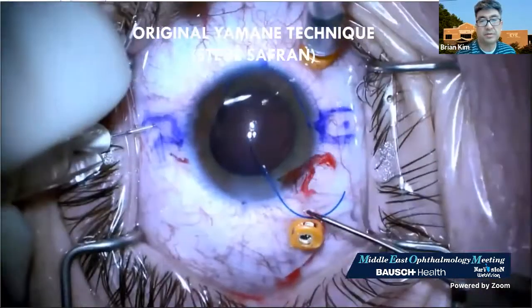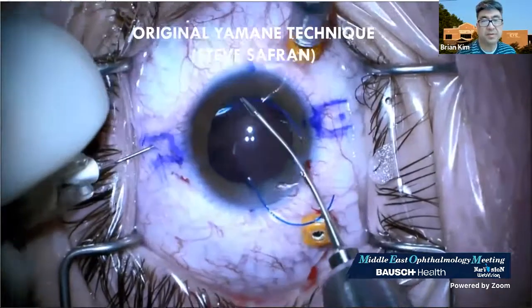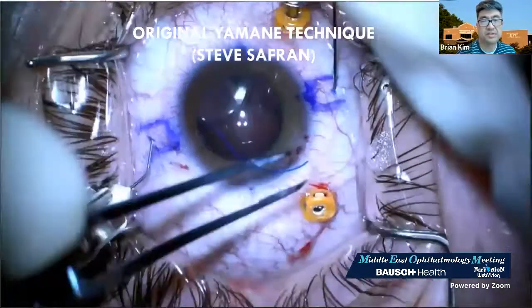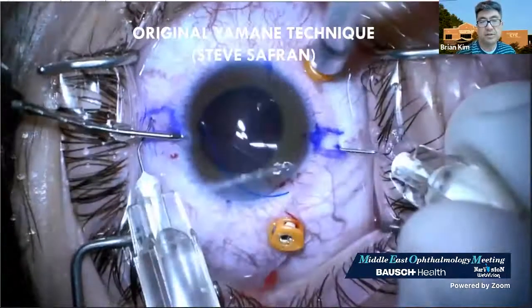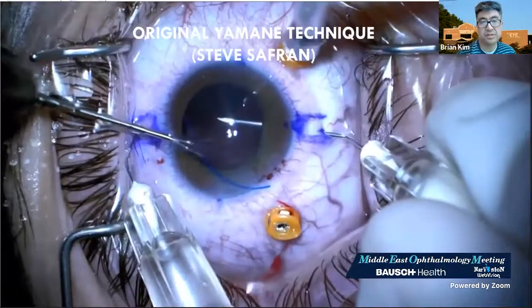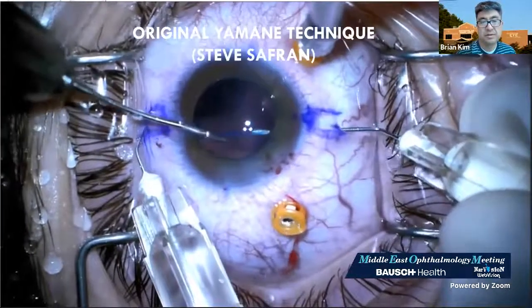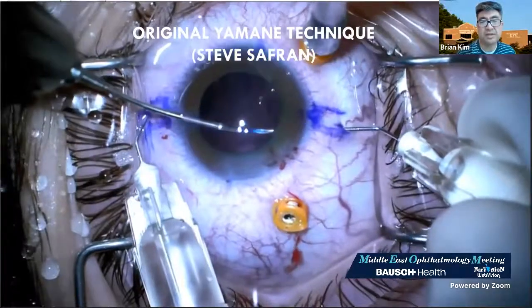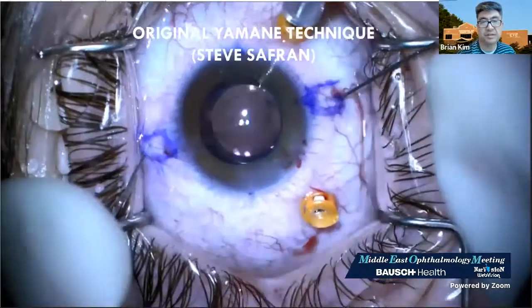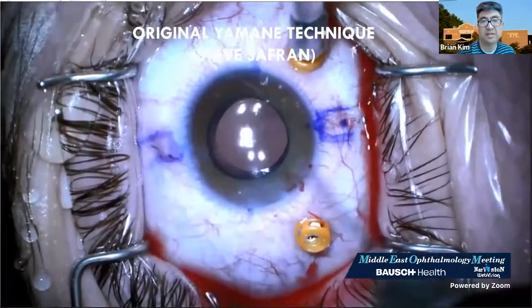And he's going to use microforceps to place the haptic into the needle, releasing the left side, doing the similar technique on the other side. And then through a paracentesis contra-incisionally, he's going to place the haptic into the needle. And he externalizes both haptics simultaneously, as Dr. Yamane does, and cauterizing the tips, creating a small flange, and then repositing the haptic into the sclera.